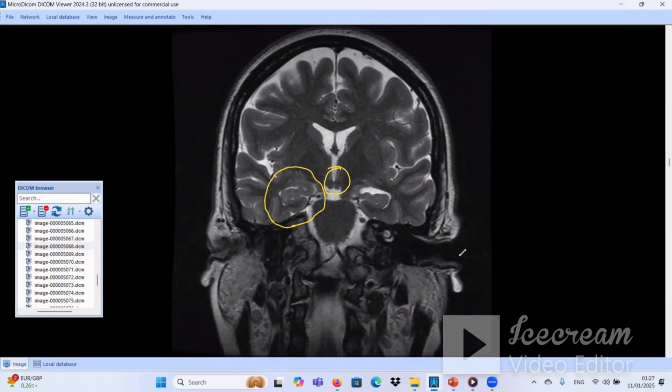Look at the other side, the contralateral side. Look at the hippocampus here. There is a little bit of digitation, but there is also a little bit of paucity of the digitation. If we are using higher field MRI scanners, you will see some striation in the right side of the hippocampus, the normal side. On the left side, there is a loss of striation.